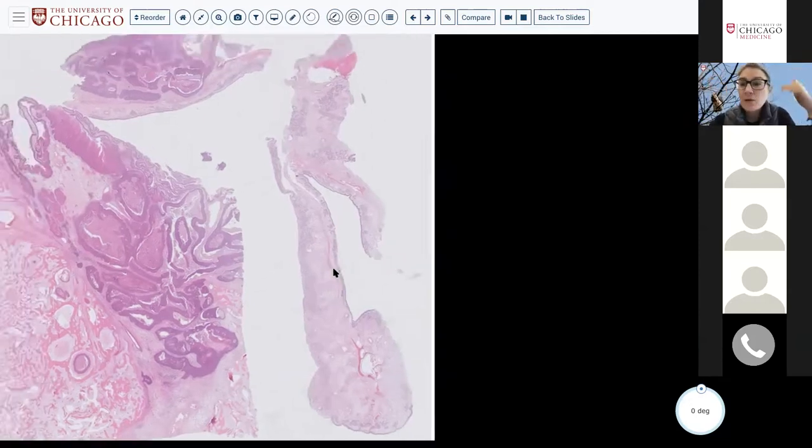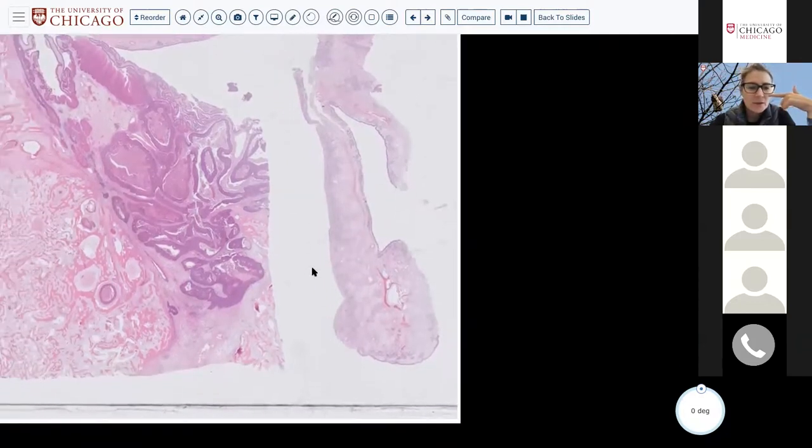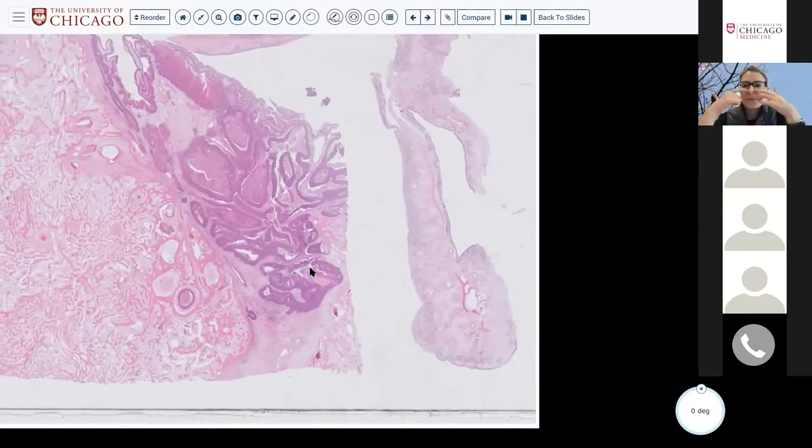So we kind of know where we are based on seeing the turbinate. So we at least know we're in the forward nasal cavity, right? We're not in the nasopharynx, which is where we might see something like adenoid. We're not necessarily in the sinus because the turbinate's a little too far forward. We're in the nasal cavity.